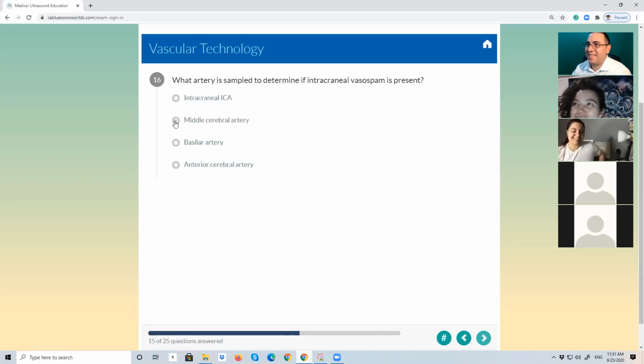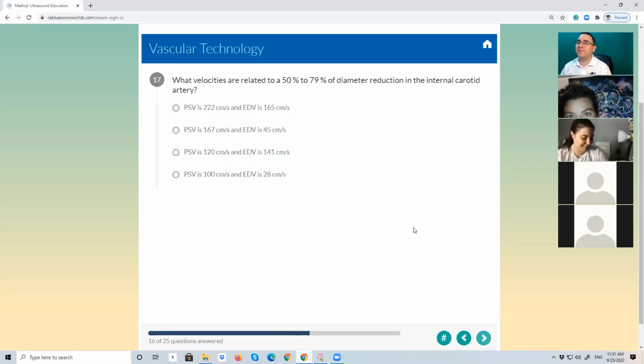120 meters per second. Mm-hmm. Oh no, time average. Yeah, the time max. 120 centimeters per second. All right. And the normal value is 50 or something? 55 plus minus 12. Yeah, for the MCA. Very good. Nice. It's a good Friday. You guys are active and activated both at the same time. Let's keep going.